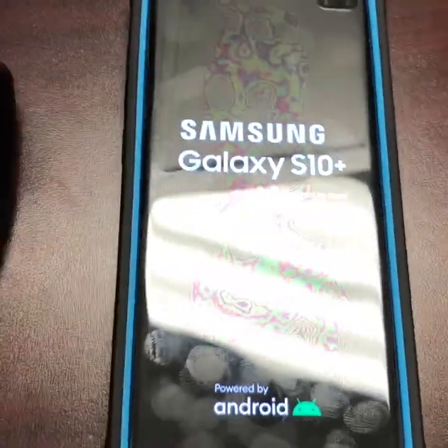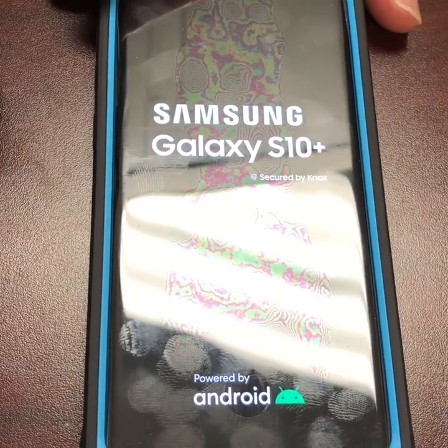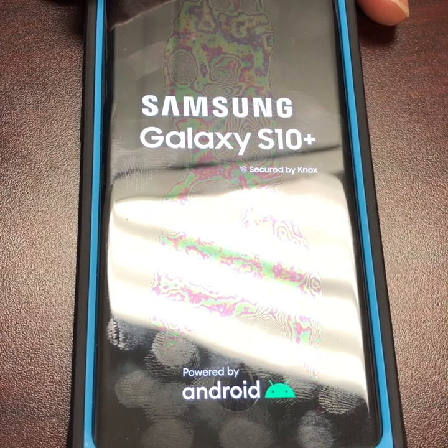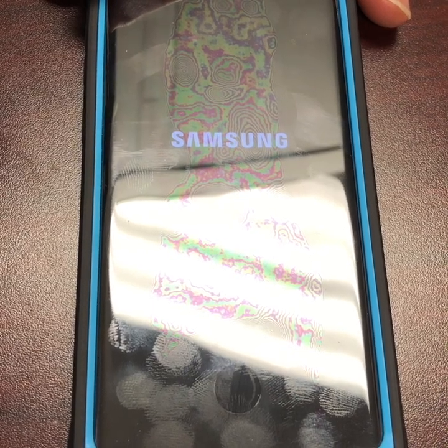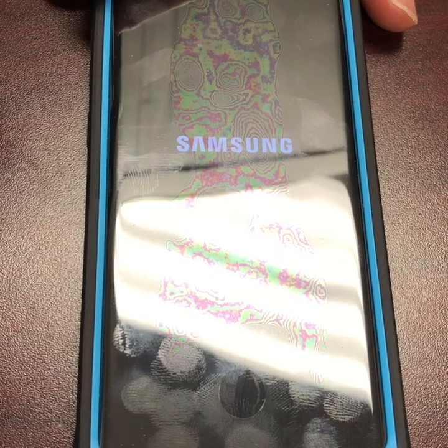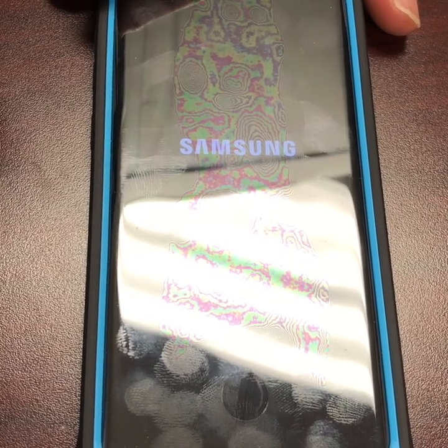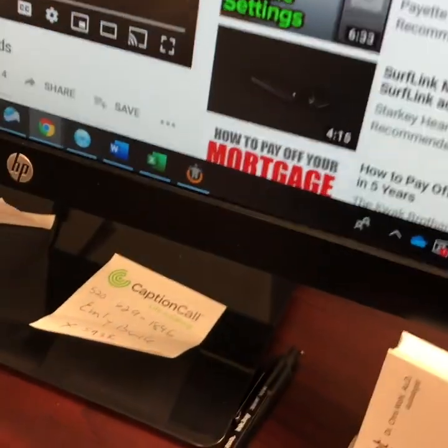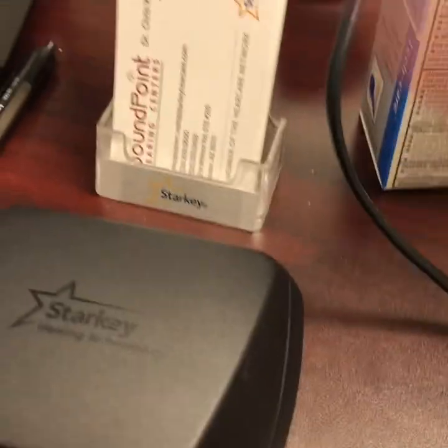Power the Android phone back on and enter the passcode. It's important to follow my instructions very closely here, or you'll keep failing at this.